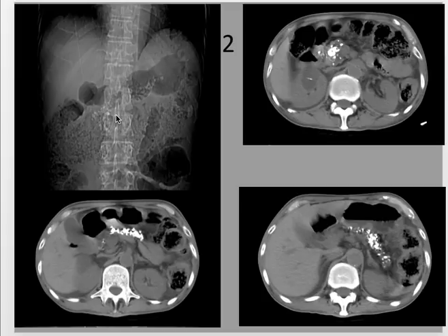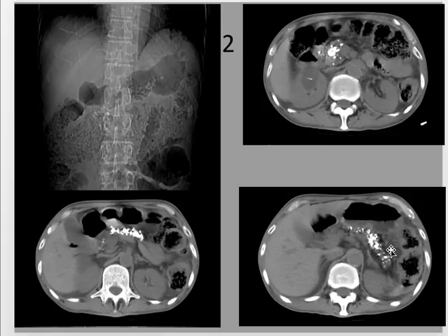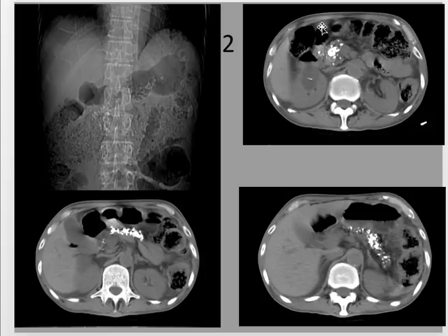Let us see what's happening in the CT scan. These are the axial sections at the level of the pancreas. Here you can see the kidneys. This is the pancreas — you can see the calcifications. This is the head of the pancreas, this is the body region, and this is the tail region. The entire pancreas shows atrophy and multiple calcifications and intraductal calculi, classically suggestive of chronic calcific pancreatitis. The CT is easy to detect this, but the X-ray is slightly difficult, and this is kept as a classic spotter in entrance questions.